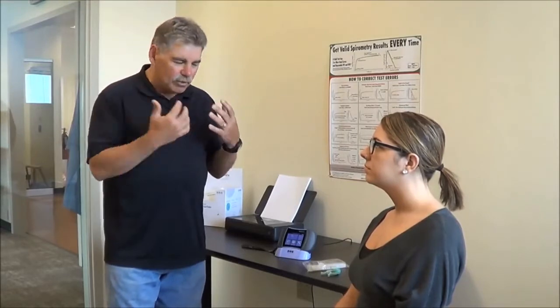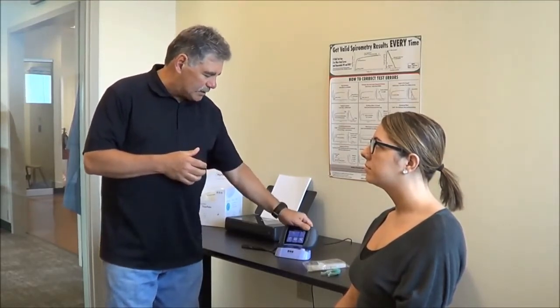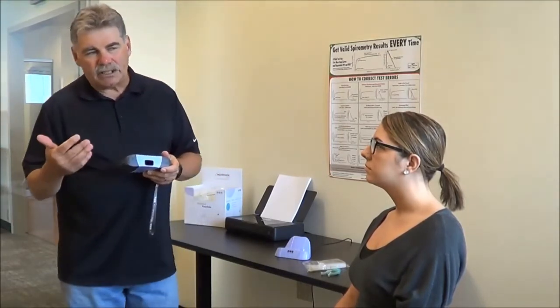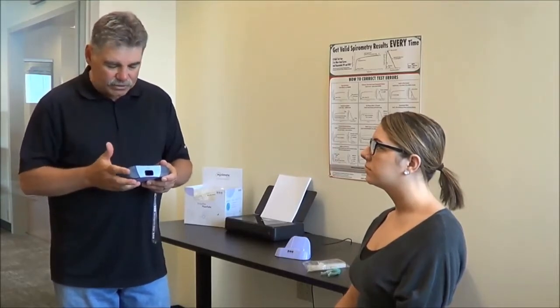So I am going to administer this test to Tina here today. To start the test, in spirometry, it's important that we enter patient information correctly. We use the age, sex, height, and ethnicity for predicted values. So it's important that all that gets entered correctly.